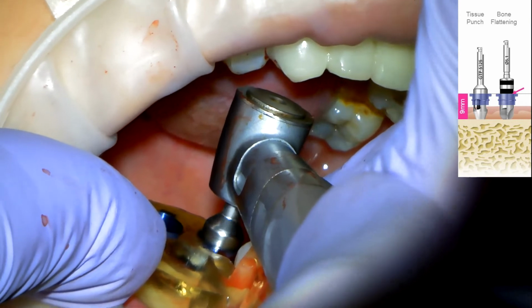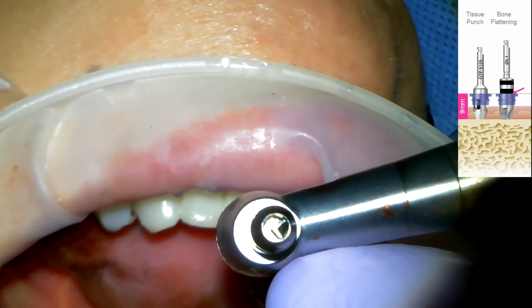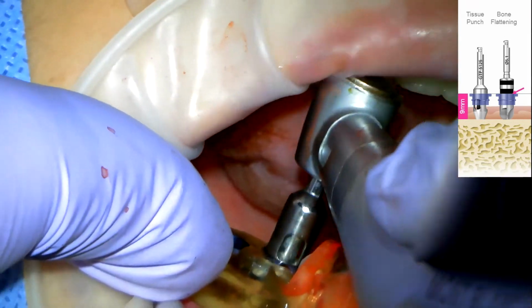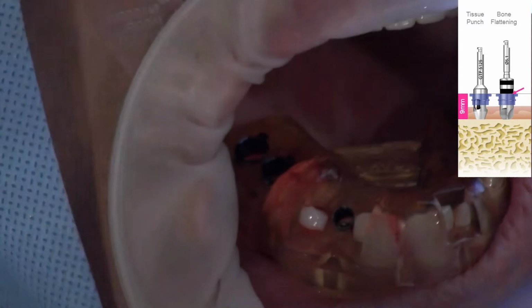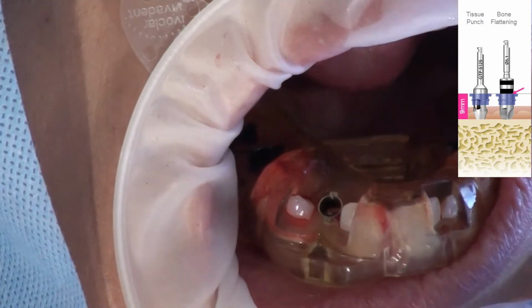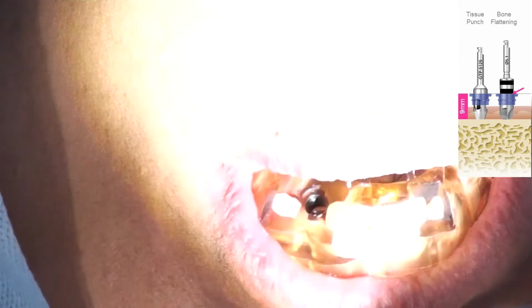I'm going to push hard, roll, and out. I didn't get it just yet. We're going to go one more time. Sometimes the drill extension might be needed. If you're a right-hander going across the arch, sometimes that drill extension is needed. I'm going to go ahead and try this one.